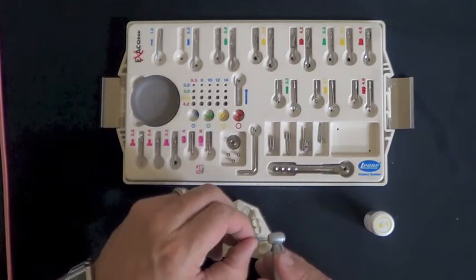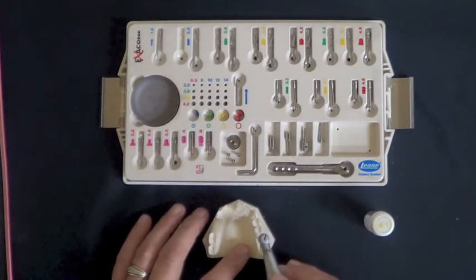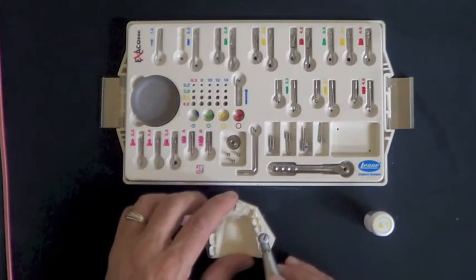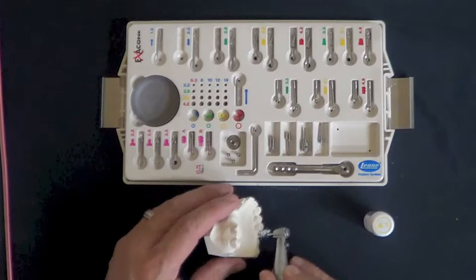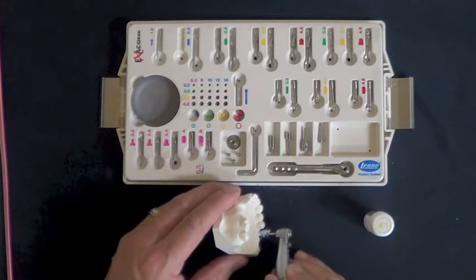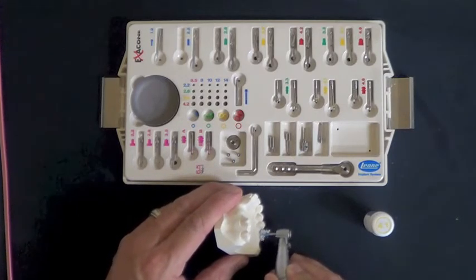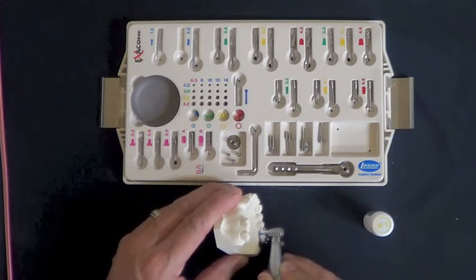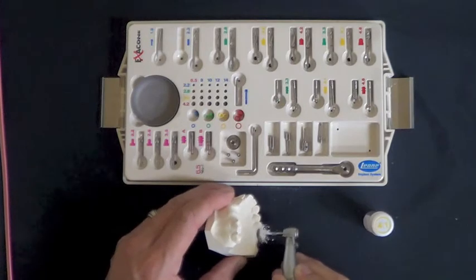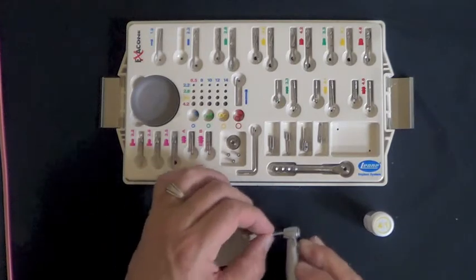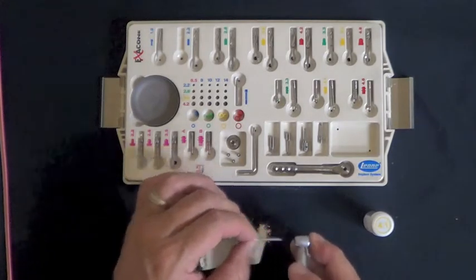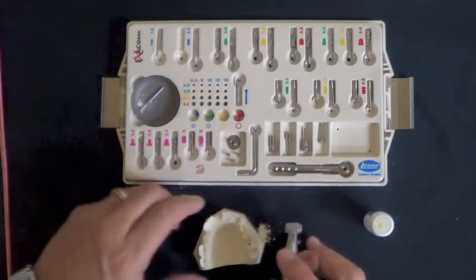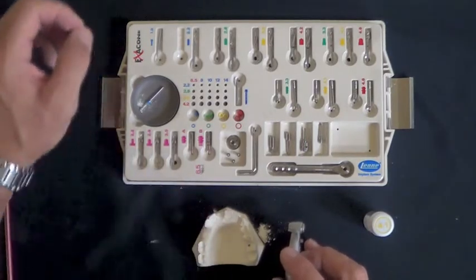Place that on the surgical handpiece, and then find the purchase, hit the pedal, and slowly direct that osteotomy down to the depth stop, which is the 10 millimeter mark. So that would be our initial pilot drill.